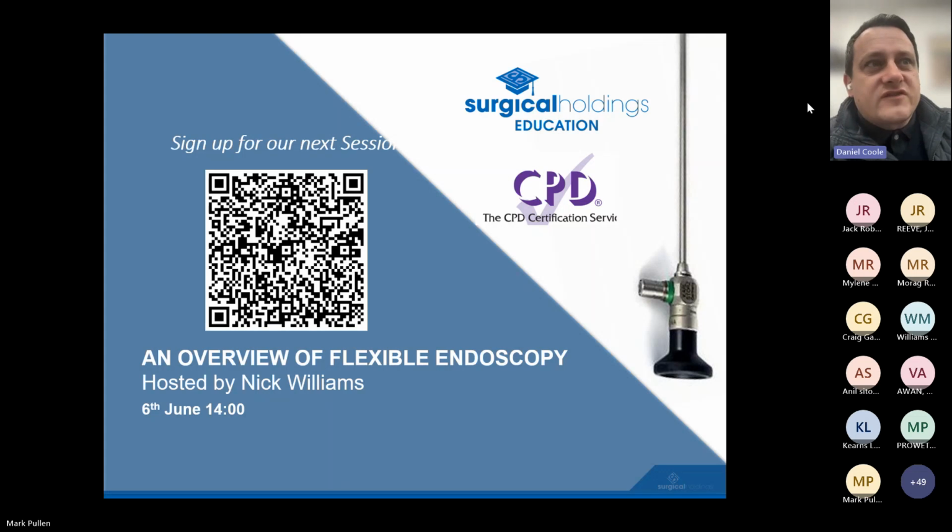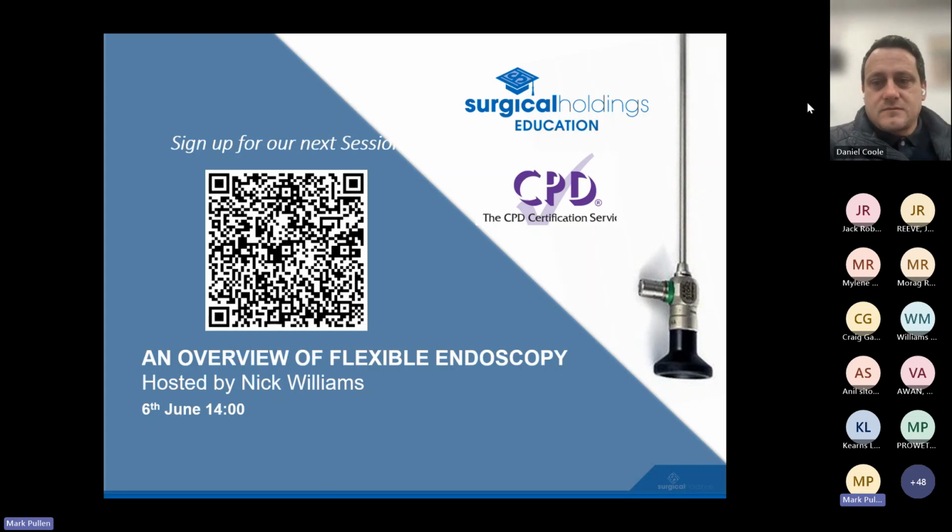But also, quite often we've seen when scopes have come in, and again, as you've highlighted, in baskets that are perceived to protect them, but actually probably doing them more damage than protecting them, Mark. Yeah, exactly. Something we've seen a few times. Like we said, it's been sent to us damaged, but it's now effectively twice as bad when it gets to us. And it goes from a minor repair to a major repair, which could be avoided. Yeah, that's it. You want to do anything you can to obviously avoid that.